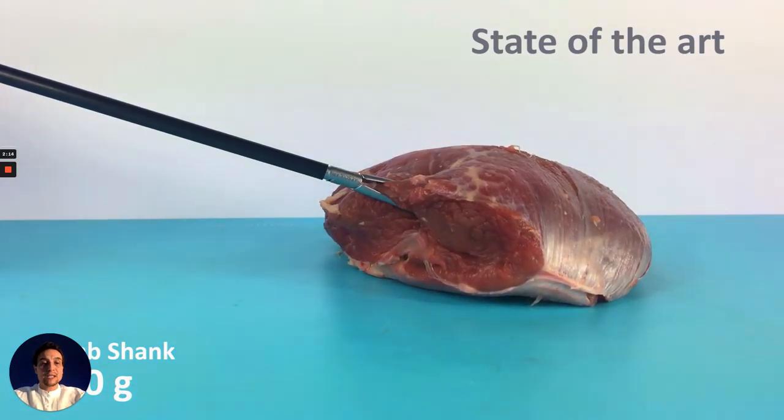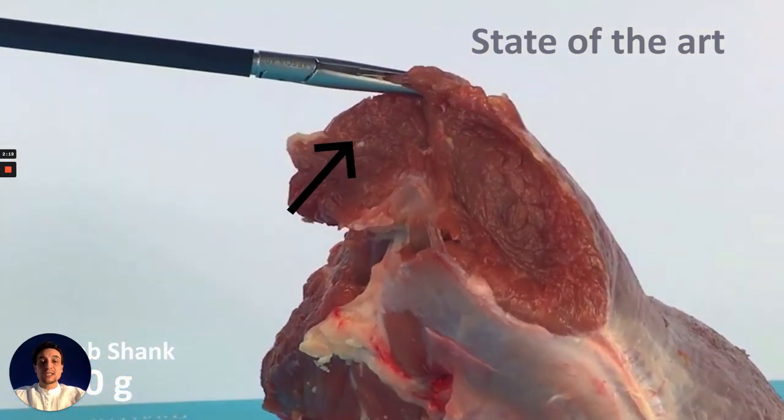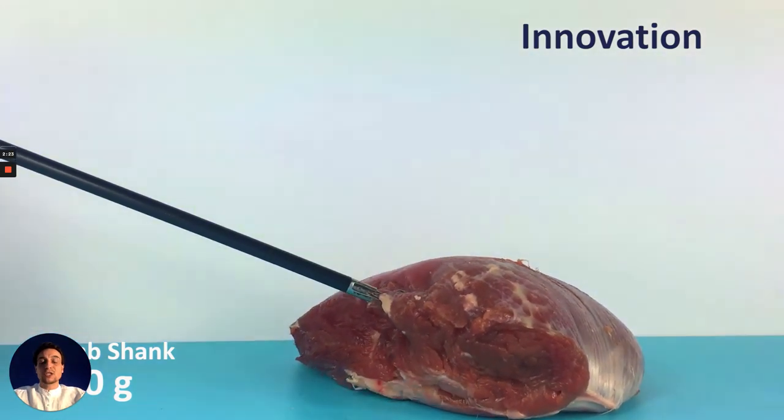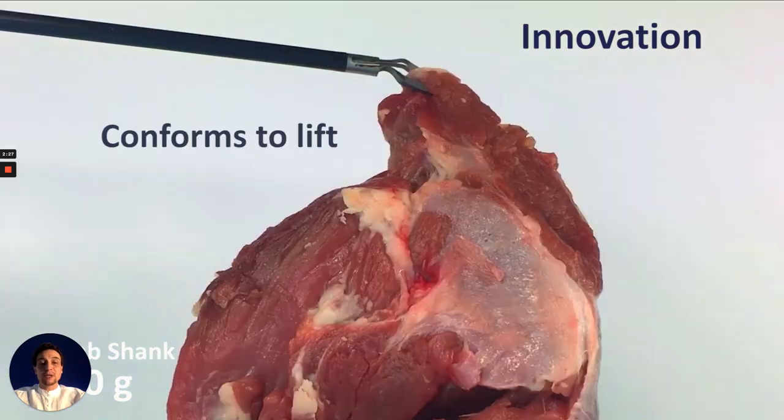When grasping and lifting tissue using state-of-the-art, stiff hinge assemblies are prone to dictating the motion trajectory. A compliant tooltip can conform to the shape of a lift like a wrist rotating while picking up an object.